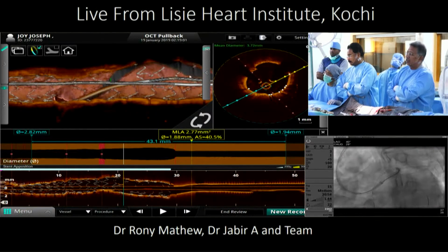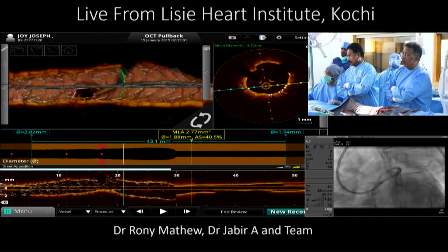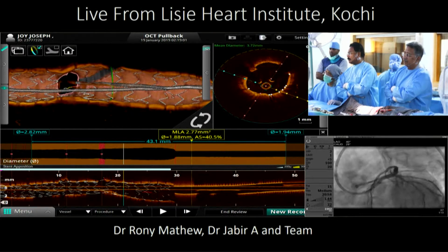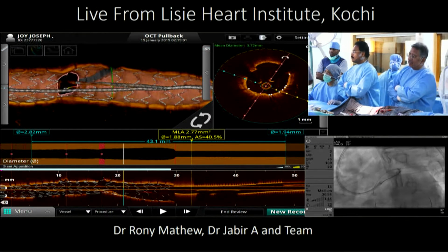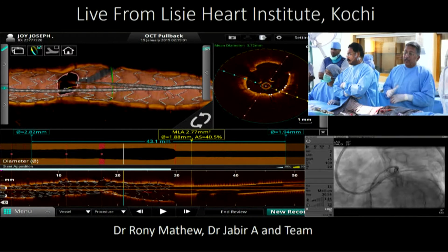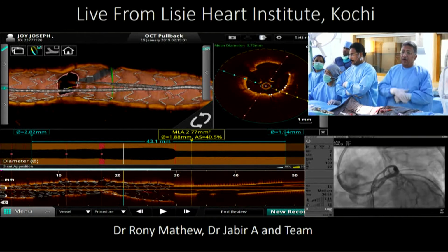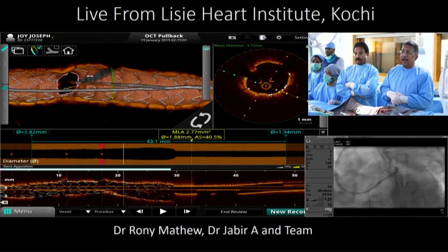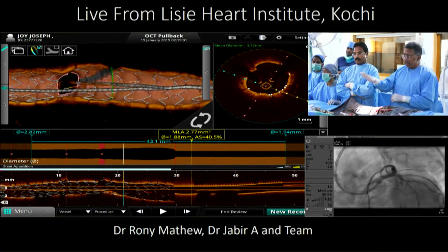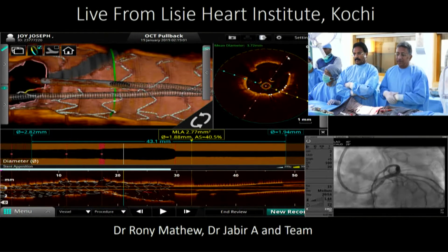Now look at this ostium. No, rotate it a little bit more. Look at that ostium. See, now that ostium has been cleared of that strut. See that? And I think this is a much better picture to leave the patient with, because I have pictures in which we have neointimal proliferation that has occurred over the crowns of the strut, and the ostium of the circumflex has become small. So when you leave something like this with a strut that's open, you feel a little more comfortable, that's all.